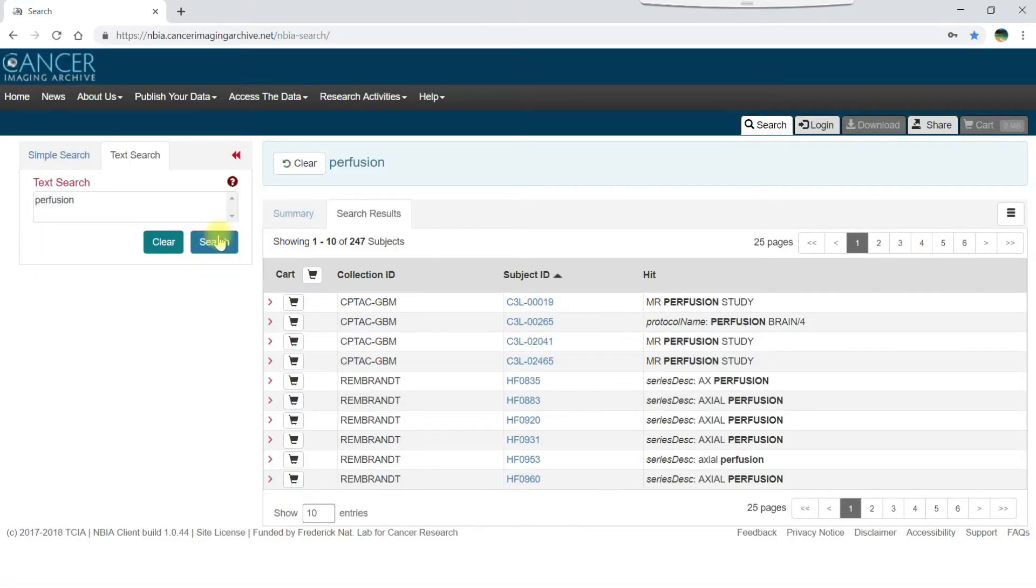You can also restrict your text search to specific DICOM tags or codes. For example, we can repeat our query for the term perfusion looking only at the series description.